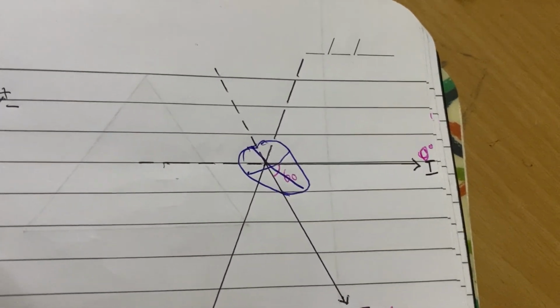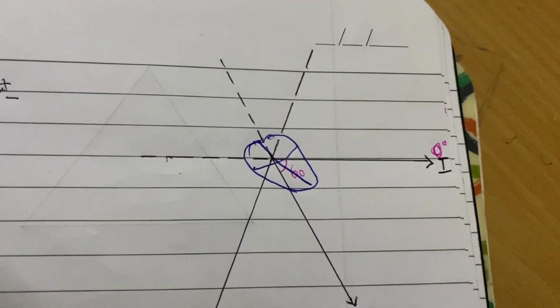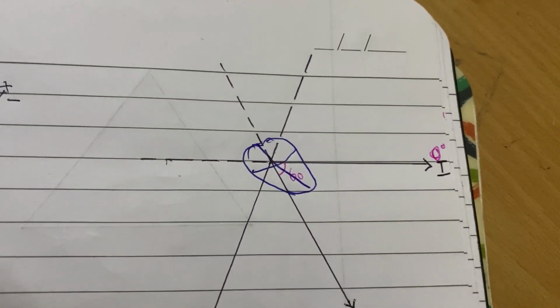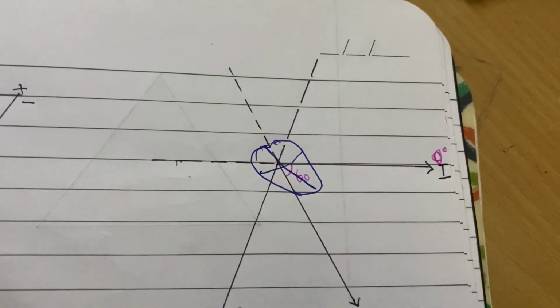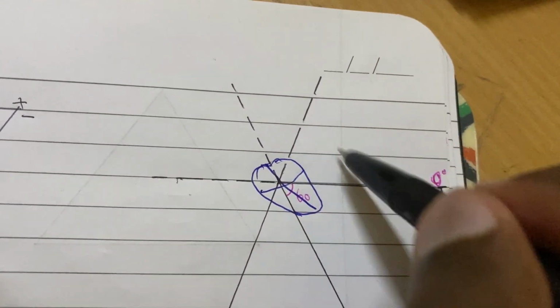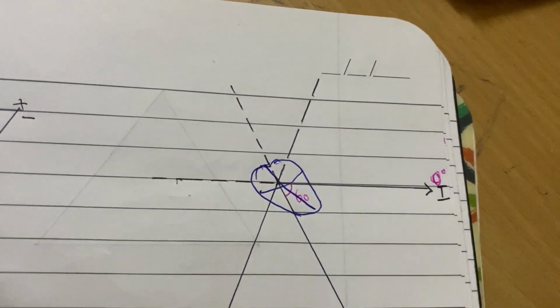They're looking superiorly and inferiorly. So if inferiorly you have this lead 3 and lead 2, from 60 to 120 there is a difference of 60. So all this part is not seen. We don't know what is happening here. We don't know what is happening anywhere above this side, and also here we don't know.